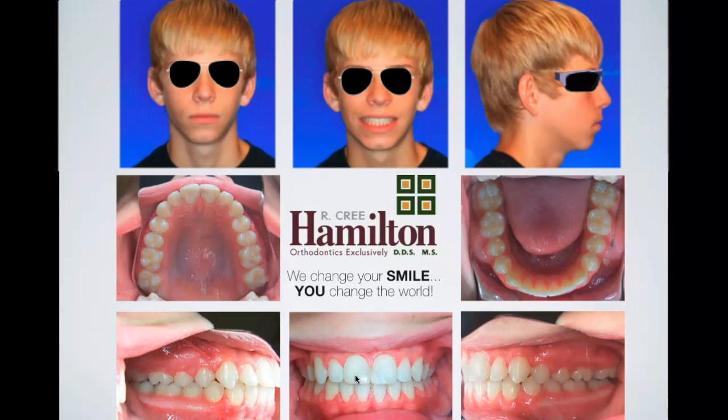His upper jaw still looks small, even though it's probably not. I mean, to your point, yeah, we uprighted those posteriors a little bit, but it doesn't really look like his upper jaw is excessively small. It's just that he's vertically deficient in the maxilla, right? You said you placed a TAD in the anterior for the extrusion.